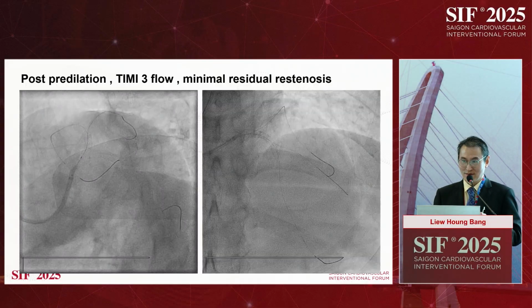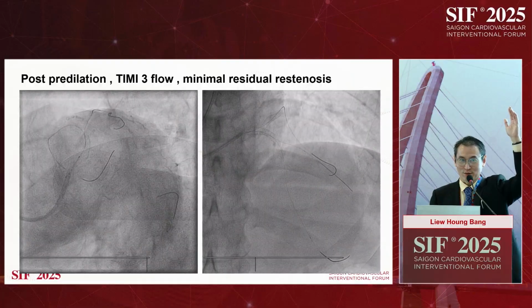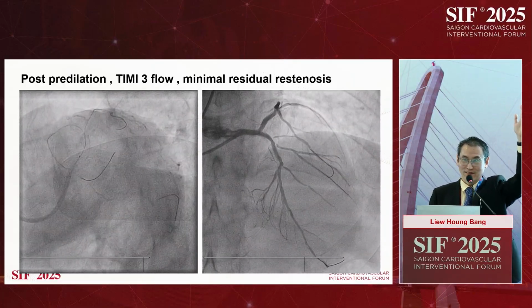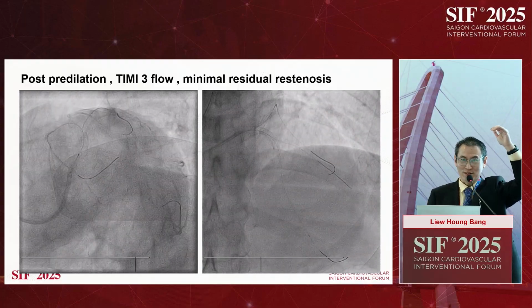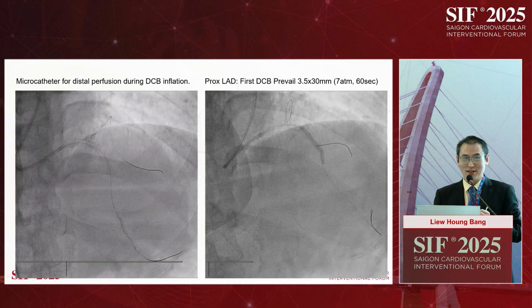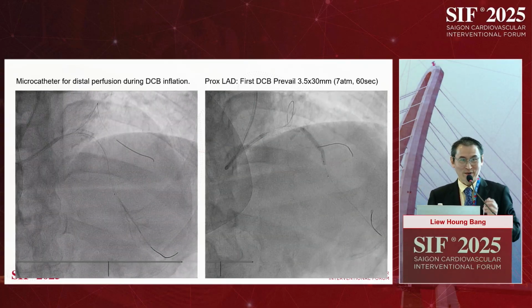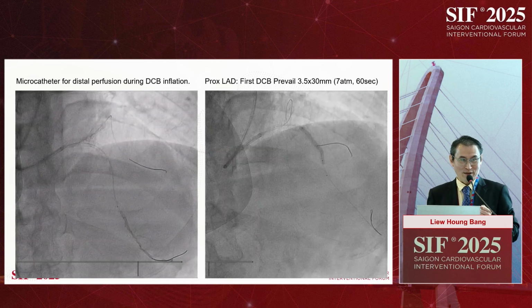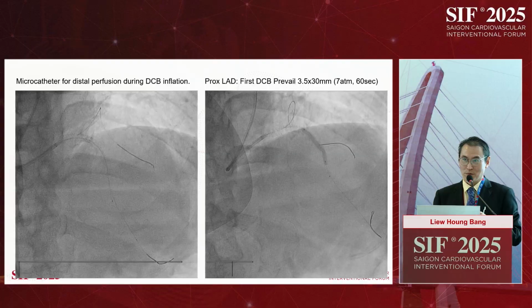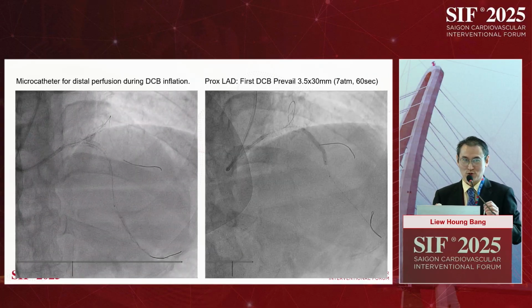More stents? So quick hands up. Who would say put more layers of stents? Hands up. Who would say put DCB? Oh, a few. Okay. And who would say a combination of both? Okay, so this is what I'll show. Earlier I was very interested to hear Dr. Chow, who presented from Vietnam, how he did it. One minute. And I always say, wow, will the patient tolerate such a long inflation time? Good thing is when we prepare these patients, we precondition them. So ischemic preconditioning is very important. But this patient, even though we tried, was not able to tolerate one minute.